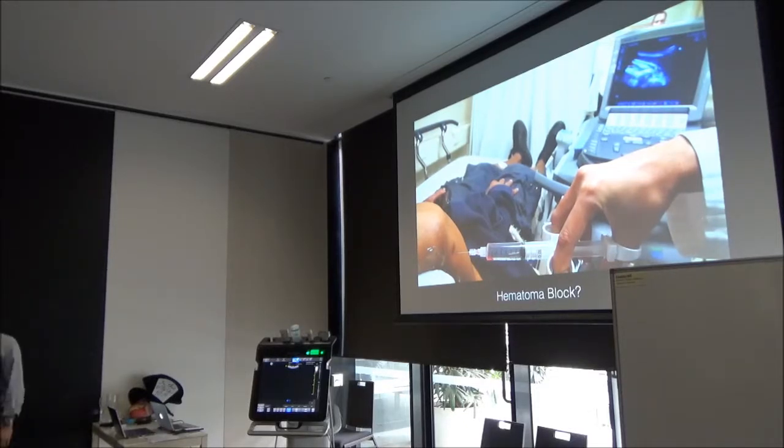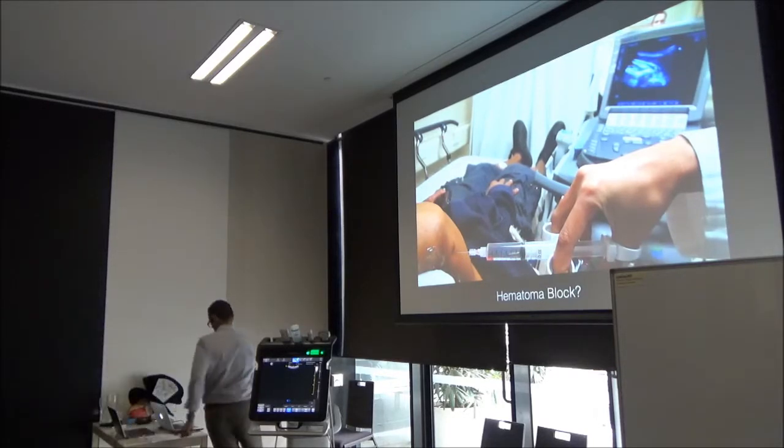And the reason I realized was, like anything else, when you have a dislocation, you have a little bit of blood in there. You kind of have to get a hematoma block. You go in, you go for flashback, I use a longer needle. I don't use the normal sized one, I use the spinal needle, longer 3.5 inch, and you get a flashback. Then you know you're underneath the infraspinatus tendon in the joint, and then you dump in the lidocaine. See that?